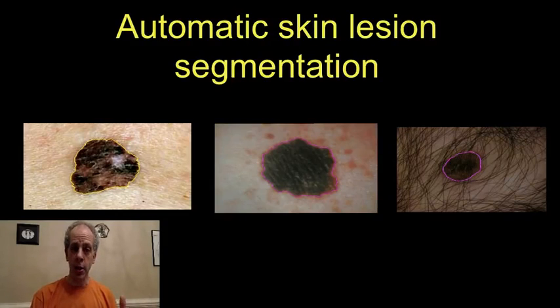Here we see images of skin, basically just regular pictures of the skin with potential lesions, potential cancer lesions. So maybe a doctor knocks on the door in our office and says, "Could you please help me? What I need to do is automatically segment out the lesion. I want to measure it. I want to measure its area. I want to measure some of its characteristics inside. And sometimes I even want to track it. I want the patient to come again, let's say after a year or after a few months or after a certain period, and control how that lesion, how that region is changing."